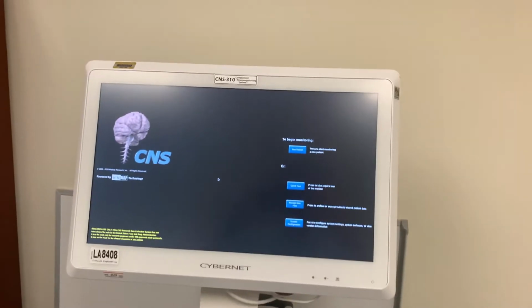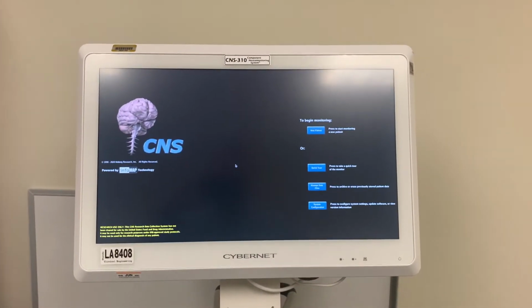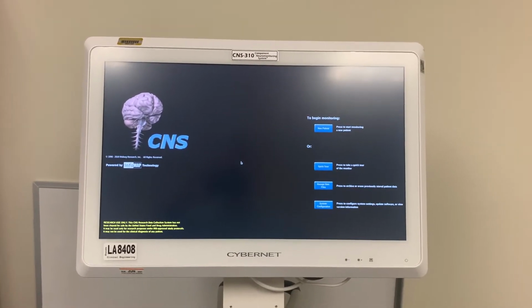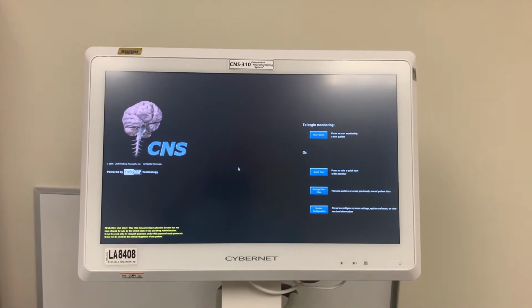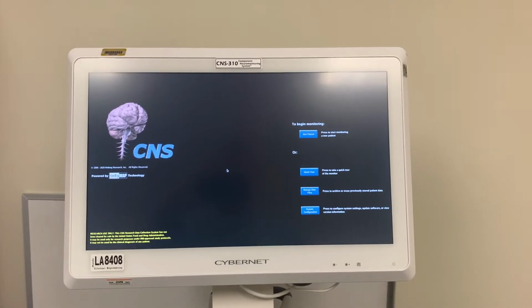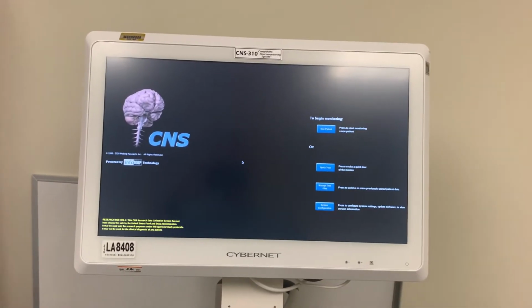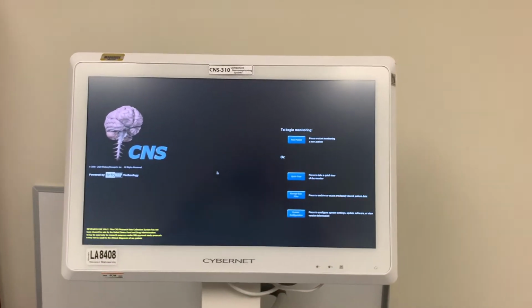I'm one of the neurointensivists here at the University of Florida, and also one of the PIs for the Boost 3 trial that we'll be conducting here at our institution for severe TBI. During the Boost trial, we will enroll patients with severe TBI, looking at either ICP alone or ICP plus brain oxygen monitoring to determine if treatment of patients' brain oxygen improves outcomes compared to standardized treatment.